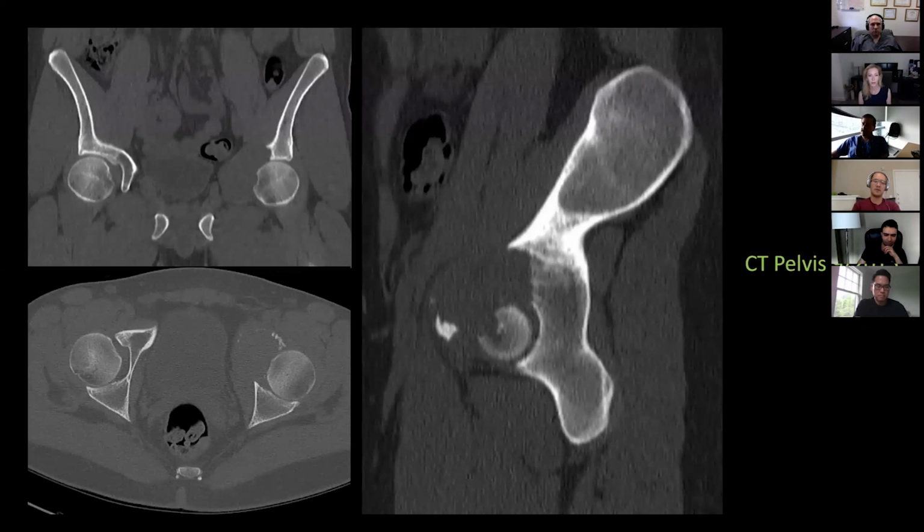So this was a CT, and you can see there's a big, huge gaping hole in his acetabulum, in the supra-acetabular region. The femoral head is like floating because there is no acetabular cover over it. So the ortho-oncologist, I bet there are some orthopedic surgeons on here also, I would love to have their comments on what they would do in a case such as this. But the ortho-oncologist at our institute at that time said it has to be more of a radical surgery than anything minimally invasive, because there's really no acetabulum cover there.